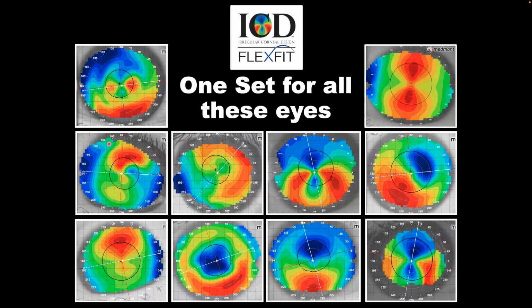Most of the patients that go for a scleral lens fit are patients that have any of these conditions that you're seeing here. And whenever you can make them feel, what I always tell them is just having three things together: comfortability, good vision, more visual acuity, and quality of the visual acuity. If we gain those three things, then we are on the right track to have a better life.